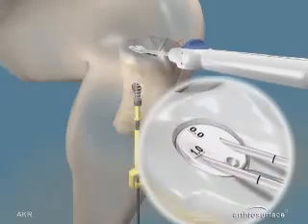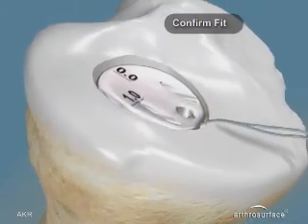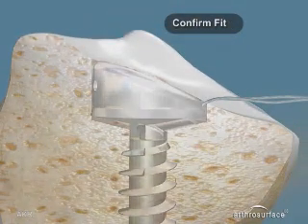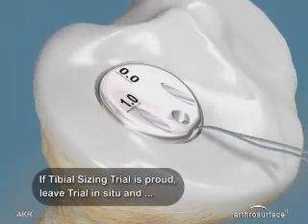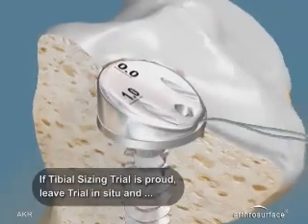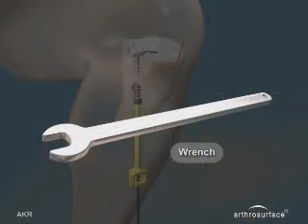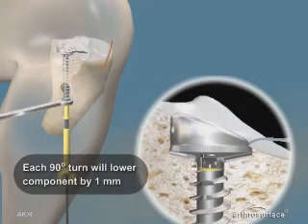Insert the tibial trial into the portal and place over the blade. Confirm the orientation of the tibial trial so that it is flush or slightly recessed medial to lateral and anterior to posterior. If the trial is proud, leave the trial in place and using the wrench, attach it to the blade stop and a 90-degree rotation will lower the blade stop by 1 mm.